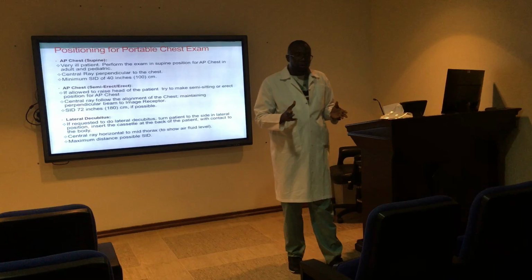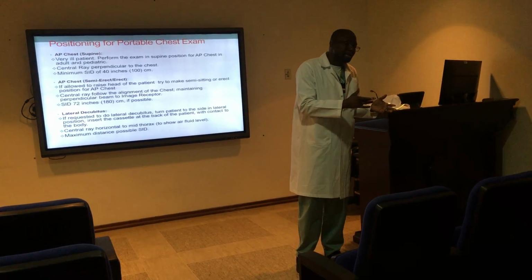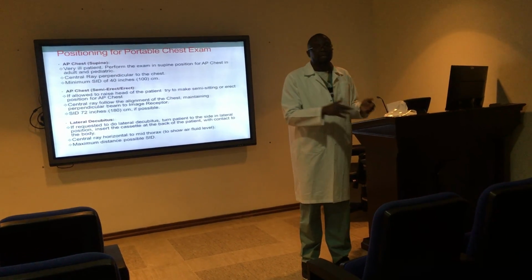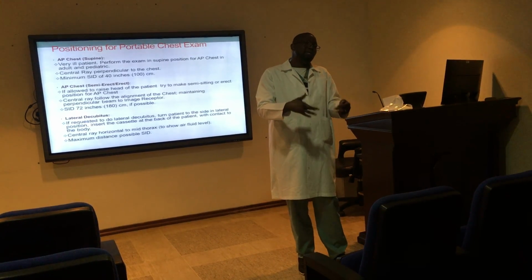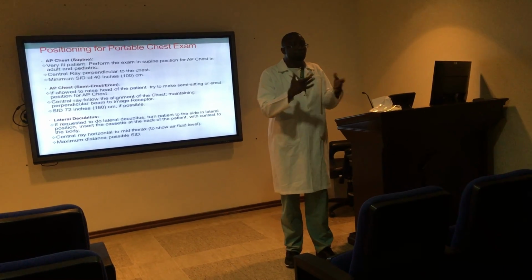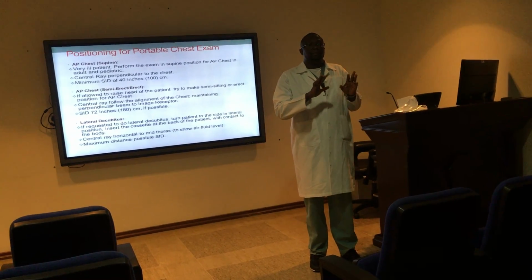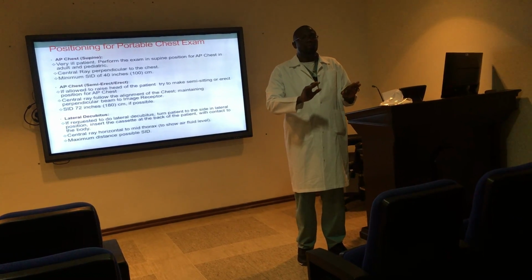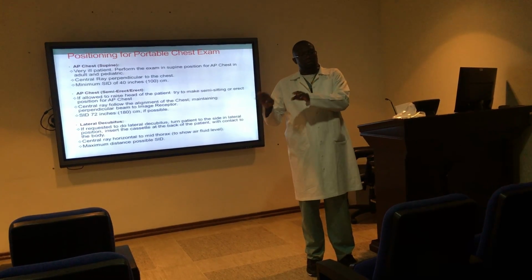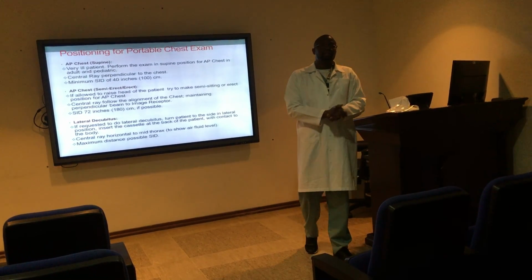If the patient can be done semi-erect or AP sitting, this is better than supine. But why do we do portable in the first place? For patients who cannot come to the department. So don't force it. For a patient who is very sick, try to do it the way that will not affect the patient's comfort or have a negative effect on the patient's health status.